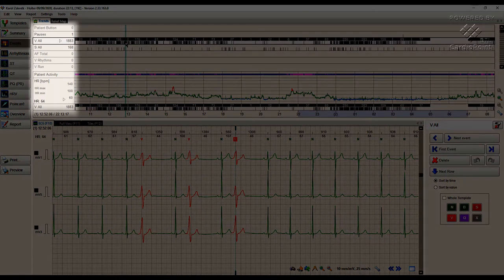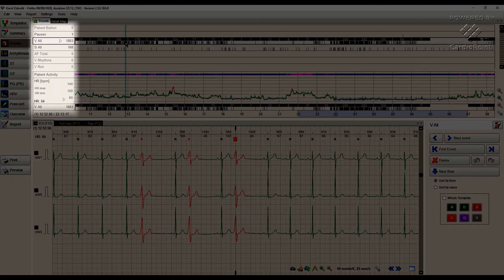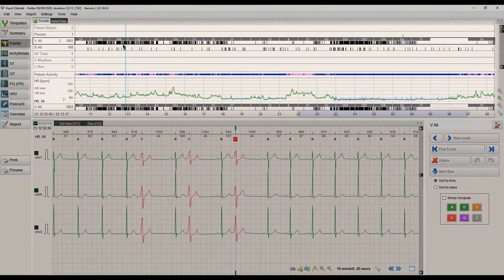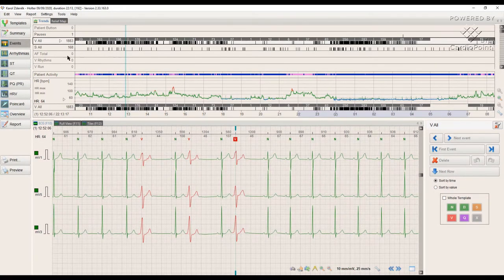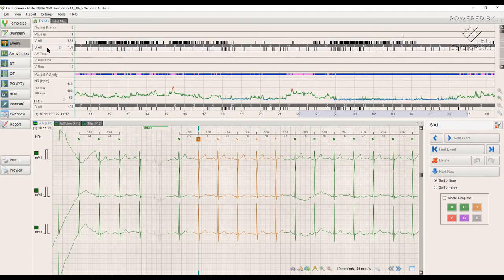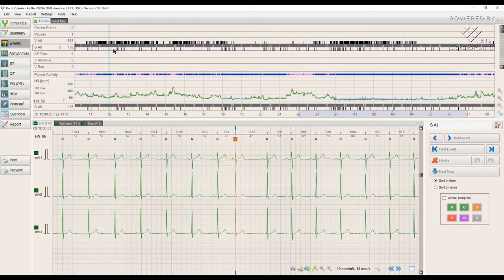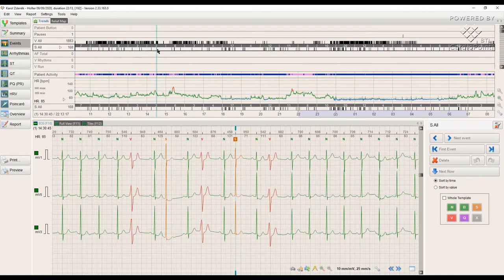Each bar in this window corresponds to a certain type of event and displays their distribution in time. It is possible to take a snapshot of the trend you're interested in to add it on the report.